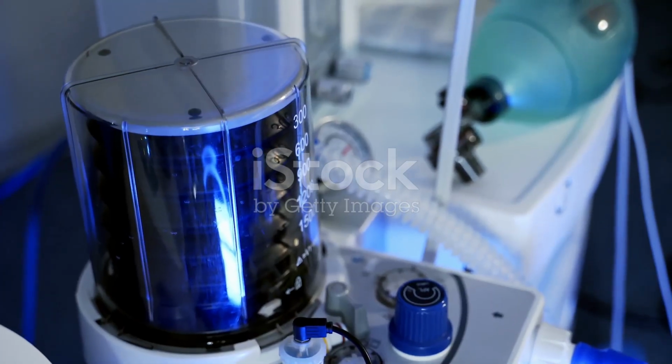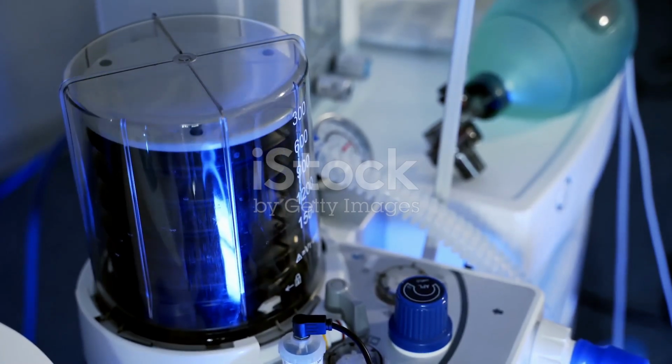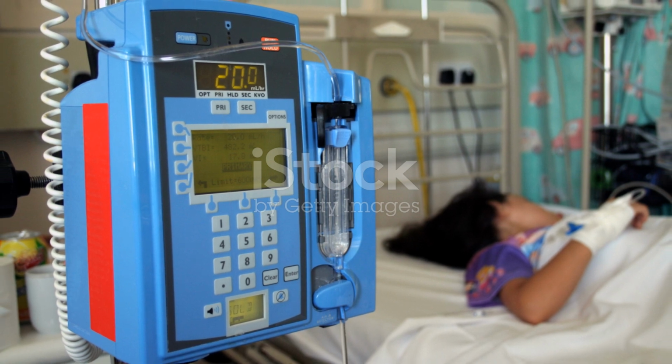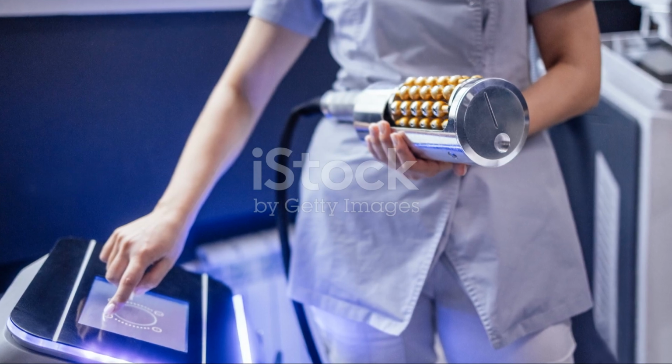However, simply setting these parameters to low values is not the solution. Each patient with ARDS has different reasons for needing mechanical ventilation. The best settings for one patient may be harmful to another.